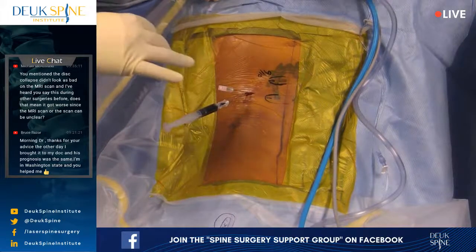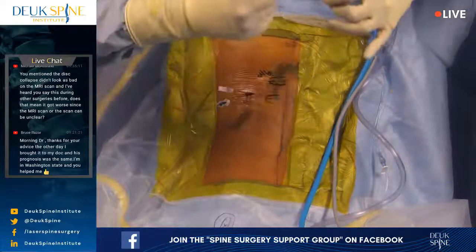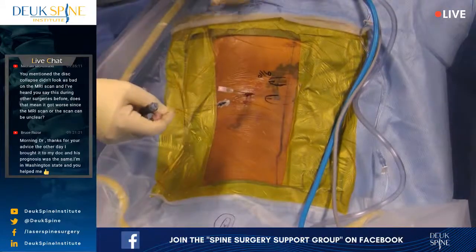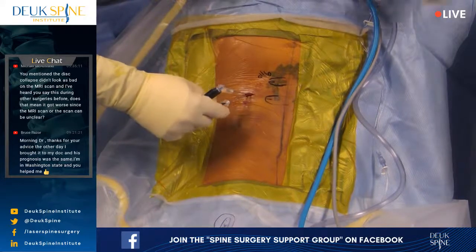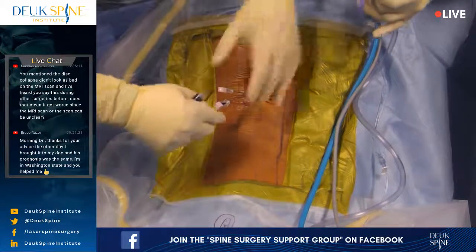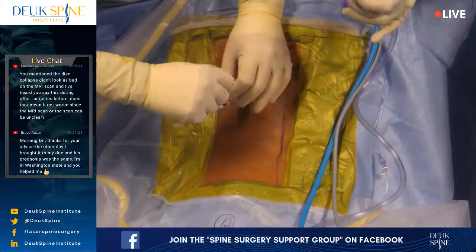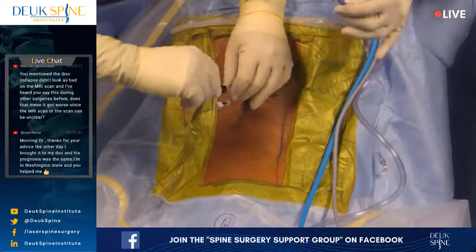But that's the area, right? Yeah. All right, so it was a 9 over 10 concordant. So I just tested the, did you get a picture? Good. I tested the L5-S1 disc, and notice how not much of the dye leaked out backwards. That's probably why it didn't go even higher, but she kind of arched. It all has to do with needle position in the disc and how big the tear is.